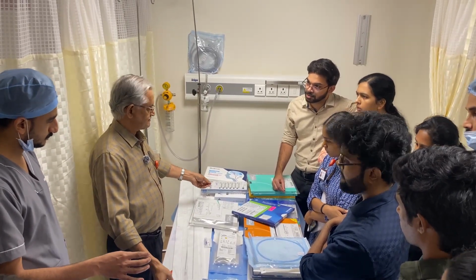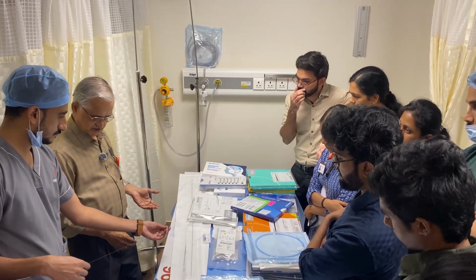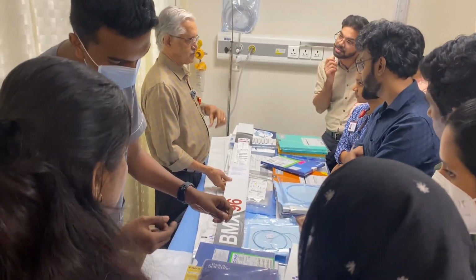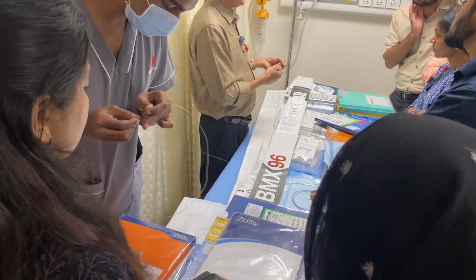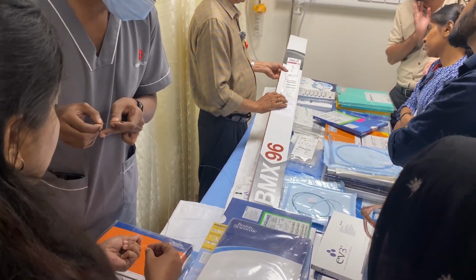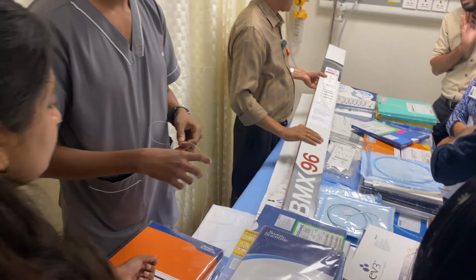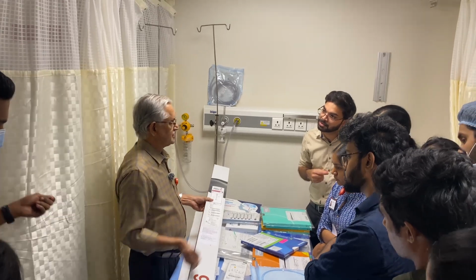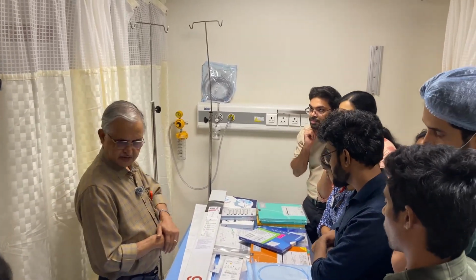thrombectomy devices. Then we also have the Penumbra catheters, the aspiration catheters. In long ICA occlusions, large occlusions and all, this retriever will not work. So you have to mechanically aspirate the thrombus. For that you use a larger, wider catheter, which can be taken into the carotid. That is the Penumbra system. And then you connect it to a negative suction device and aspirate the thrombus, the larger clots. Stroke, we have seen; now the carotid angioplasty devices.